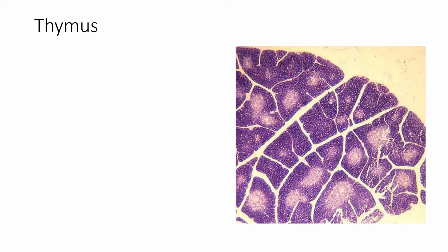These individual units are the follicles of the thymus, and the follicles of the thymus all have an inner layer and an outer layer. The cortex is the outer, darker layer. The medulla is the inner, lighter layer. You're going to want to remember those two words, cortex and medulla, because you're going to see them over and over again throughout the rest of AMP2.